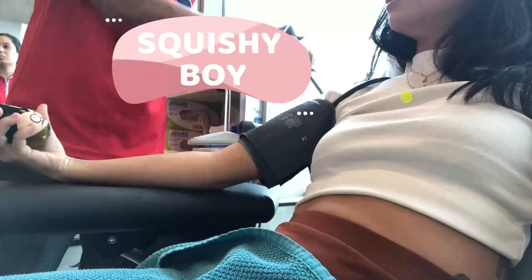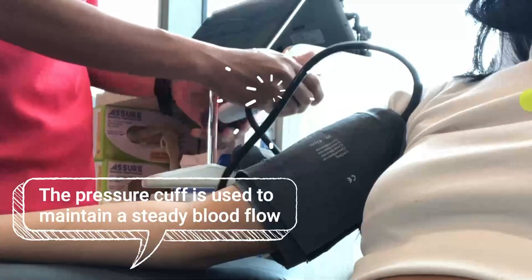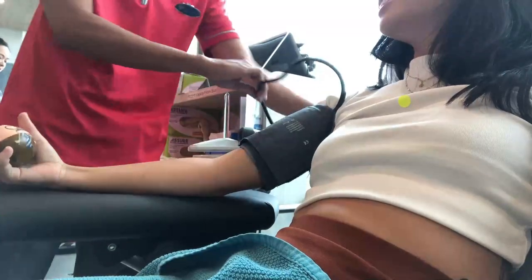So they give you a squishy boy — you hold the squishy boy and you can squish him. He's checking my blood pressure right now because that's also something that's crucial, and they just want to make sure you're fit for donation, so don't faint.